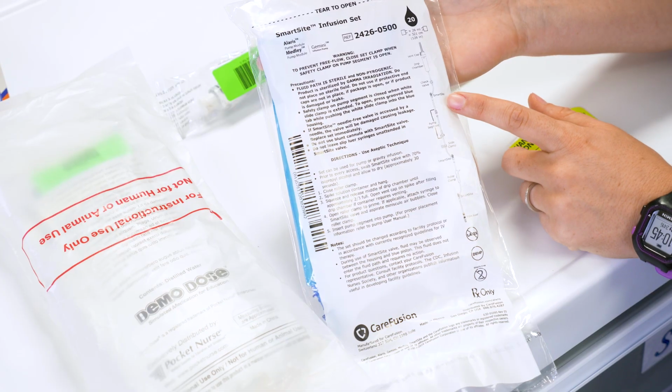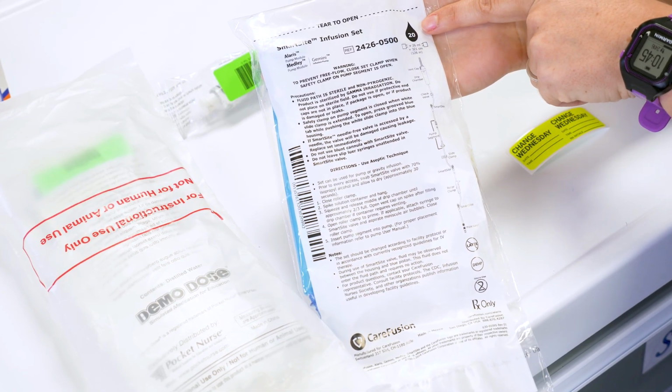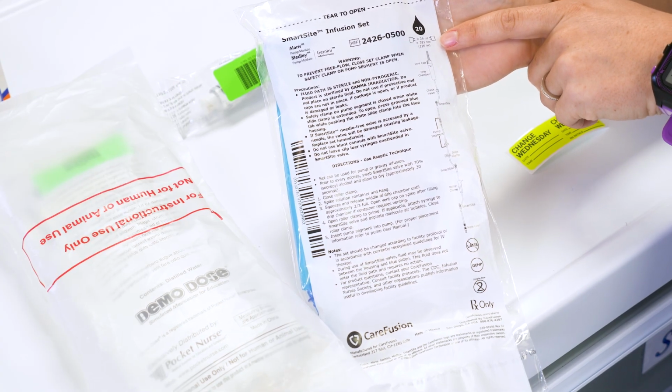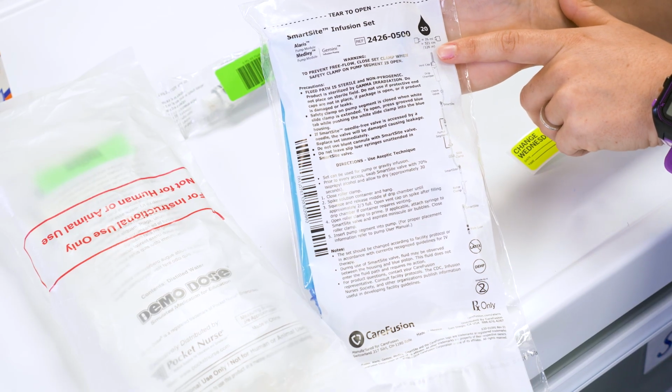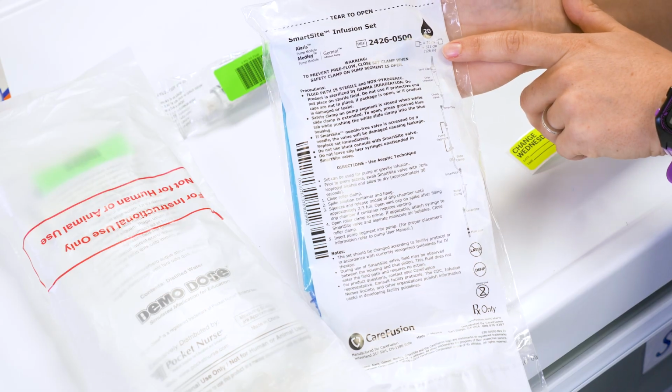So this is my primary tubing setup. You can see over here that the bag tells you how many drops per mL, and it also tells you over here how much fluid you need to prime your IV line. For this primary IV tubing, you need 26 mL to prime from start to finish.